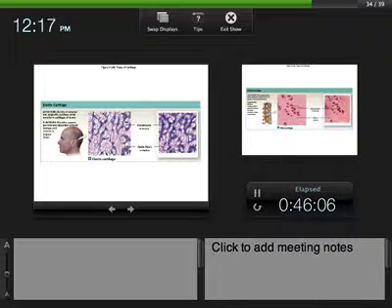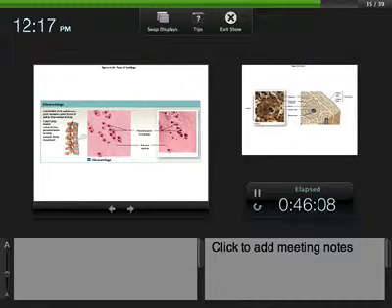Okay. And then the third type of cartilage is called fibrocartilage. Fibrocartilage has the matrix itself. The fibers are all oriented. They have a very discrete orientation that gives it particular tensile strength along the orientation of those fibers. Still have chondrocytes in the lacuna.